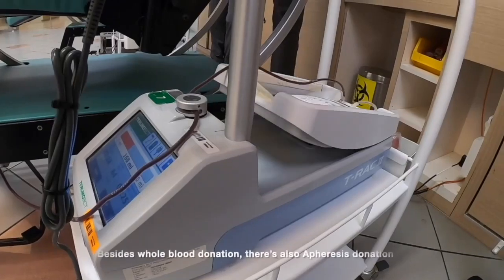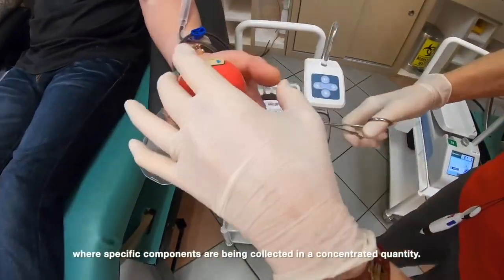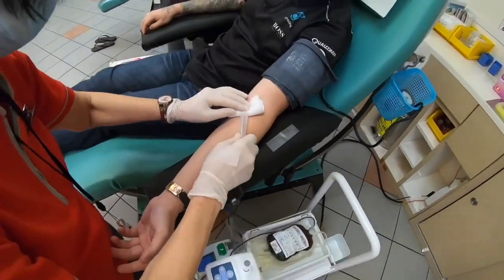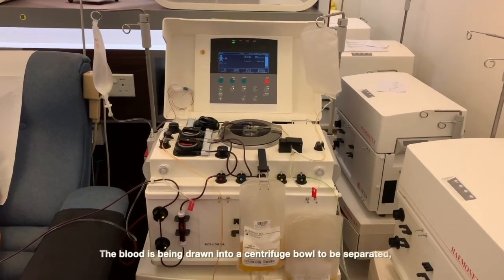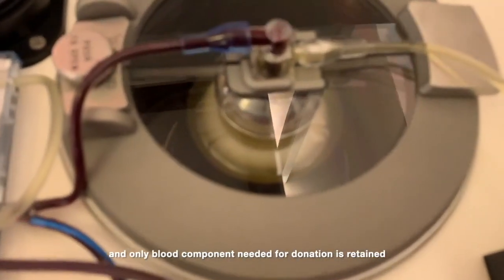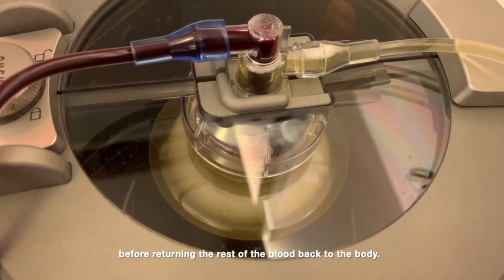Besides whole blood donation, there is also apheresis donation where specific components are being collected in a concentrated quantity. These components are platelets, plasma, or red cells. The blood is drawn into a centrifuge bowl to be separated, and only the blood component needed for donation is retained before returning the rest of the blood back to the body.